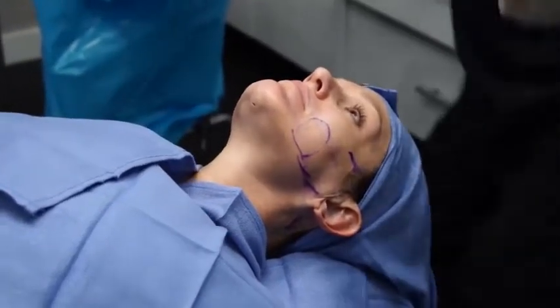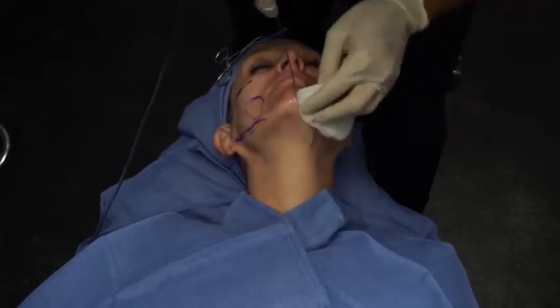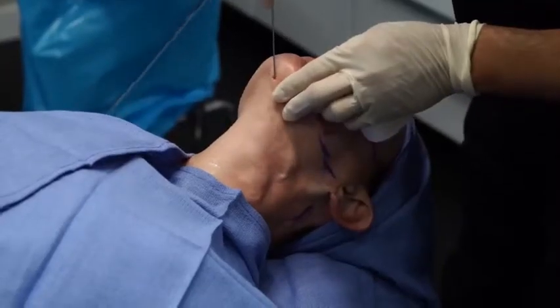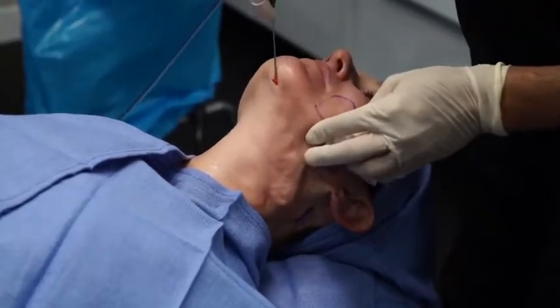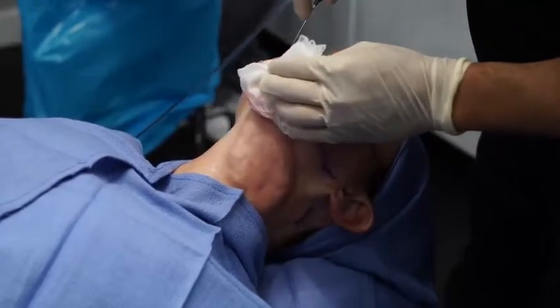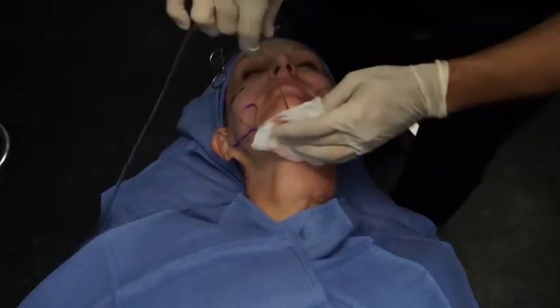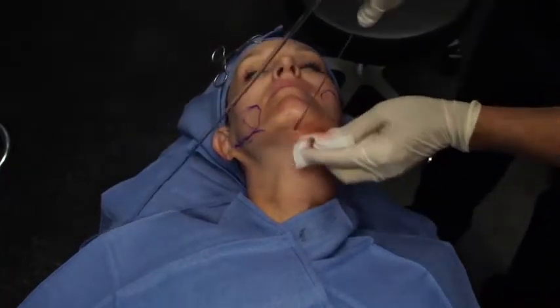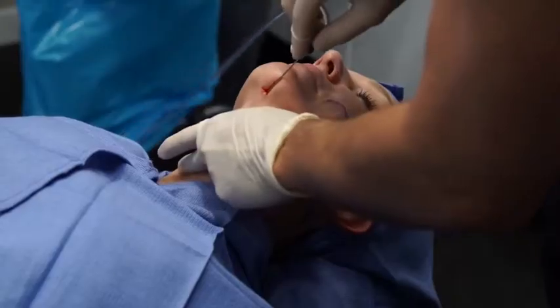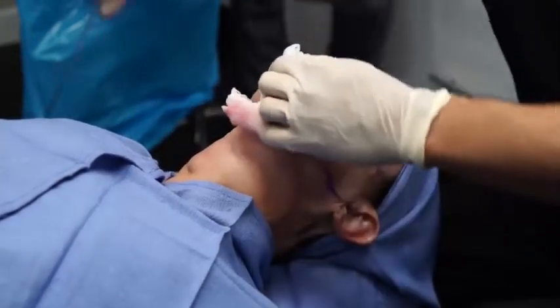A 15 blade is used for our submental incision. And tumescent anesthesia, again, we're using a 750 milligram per liter concentration, chin way up, on an infusion pump. Little pinchy, how's that, okay? Mm-hmm. And notice we're infusing in an anterograde fashion. Here we're using a rate of 250 cc's per minute and trying to really tumesce our treatment zone. Not only is the tumescent going to help with control of pain and bleeding, but it's also going to help with the transmission of the plasma and radiofrequency energy provided by the Renuvion unit. How is this, okay? Mm-hmm. Turn to the left.